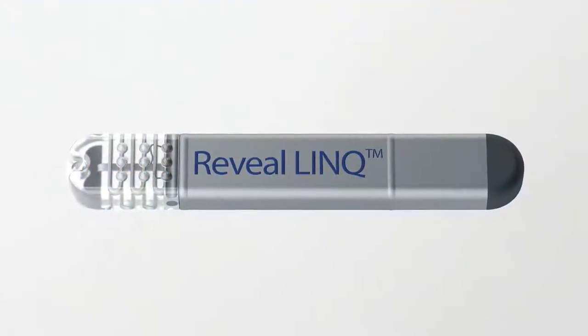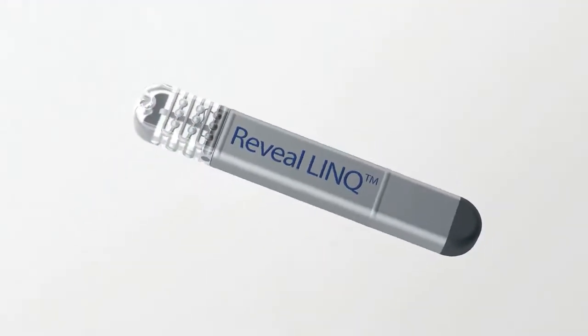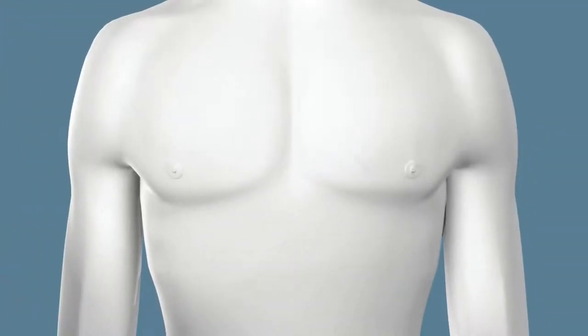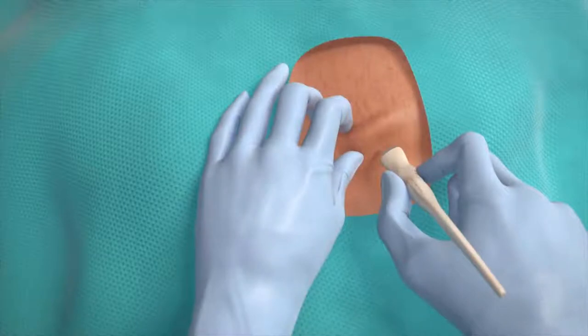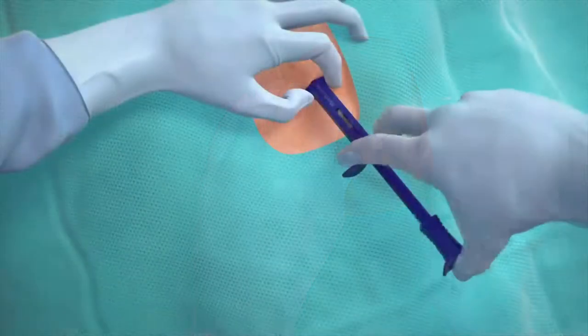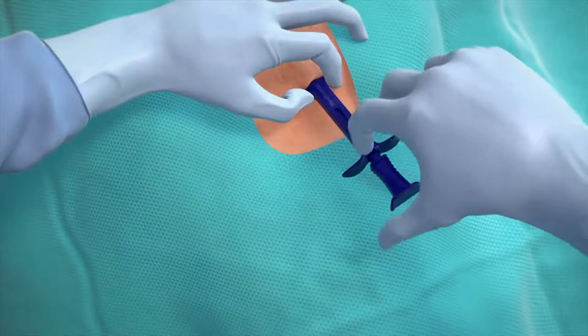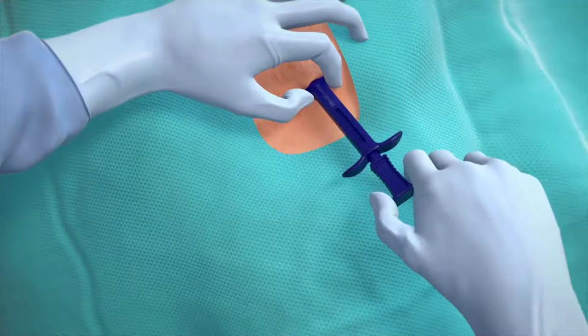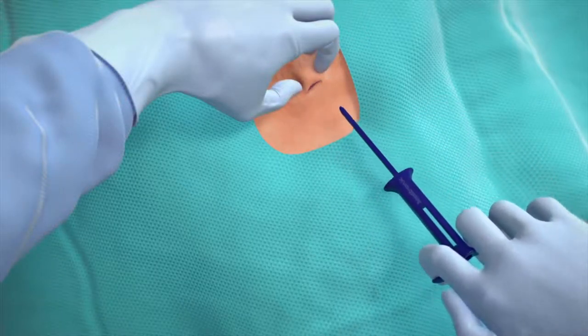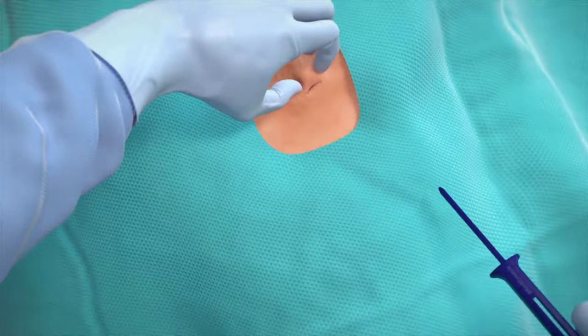The Reveal LINQ ICM is the smallest of its kind. This tiny device is inserted just under the skin during a short outpatient procedure. Your doctor will pinch the skin and make an incision of less than one centimeter. Then, using a specifically designed tool, the Reveal LINQ is inserted just under the skin. Once in position, the insertion tool is removed and the incision is closed.